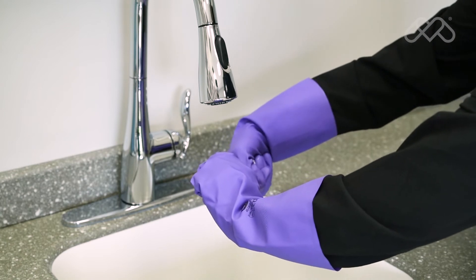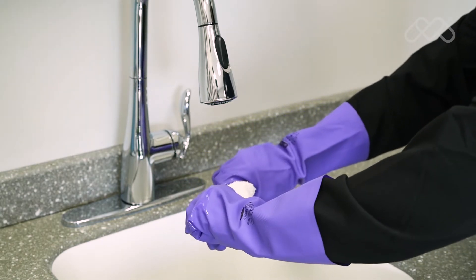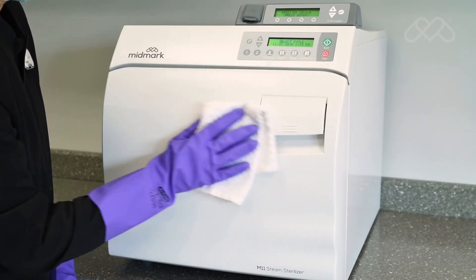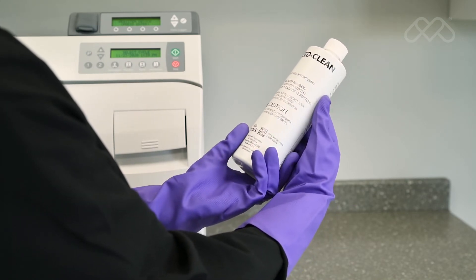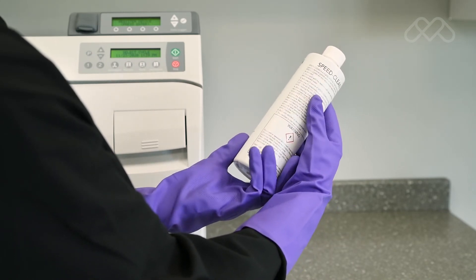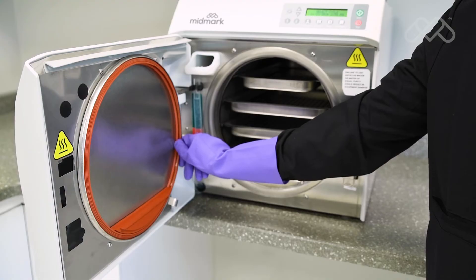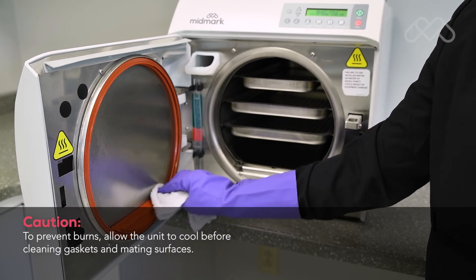To clean and disinfect the surface of the sterilizer, begin by wringing excess solution from the cloth. Using a soft cloth, wipe all external surfaces. Follow the instructions provided with the cleaner or disinfectant used regarding rinsing and drying of the external surfaces. Examine gaskets for possible damage, then clean the gaskets and mating surfaces with a damp cloth.